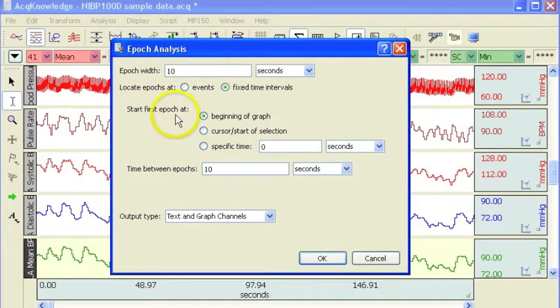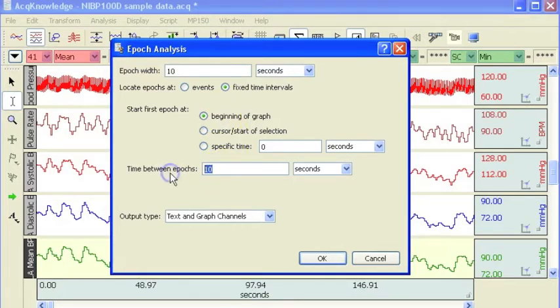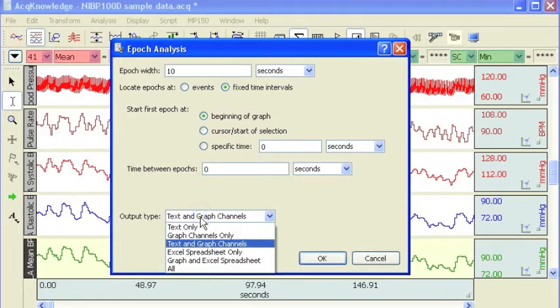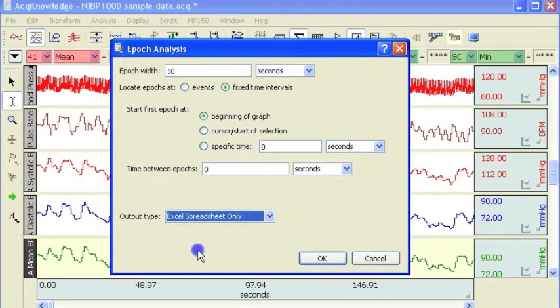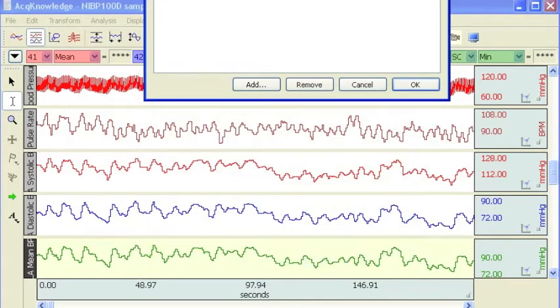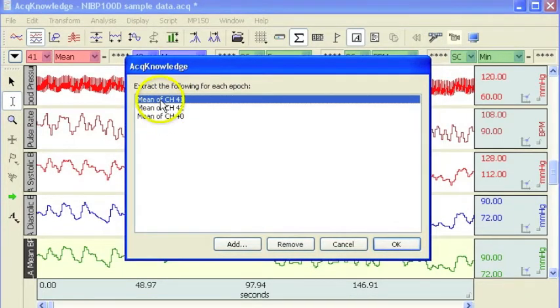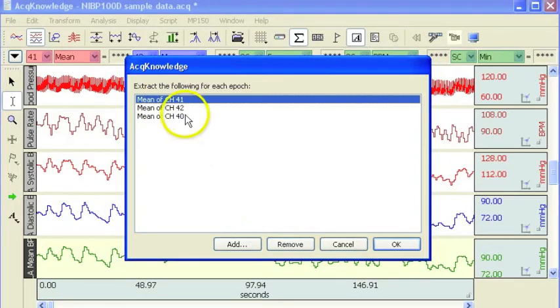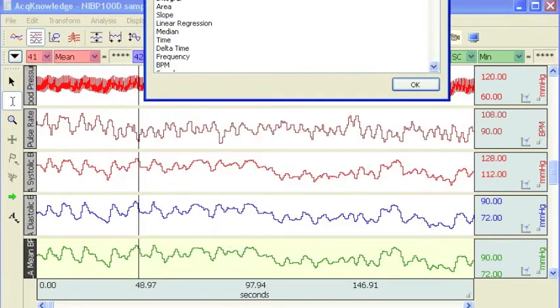I'm going to start at the beginning of the graph, so at time point zero, and I'm going to take a measurement every 10 seconds. I'm going to output my results to a spreadsheet and I've already set up some measurement boxes here, so I'm taking the mean value from different channels and I'll show you how this works.